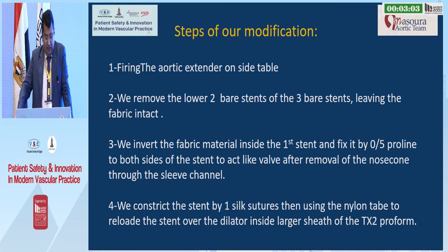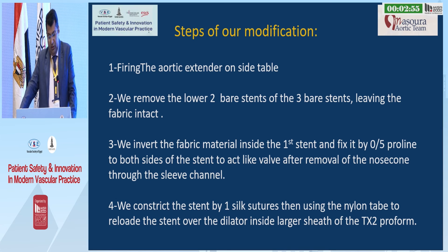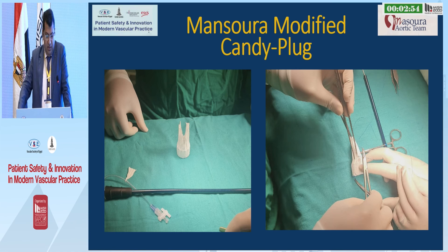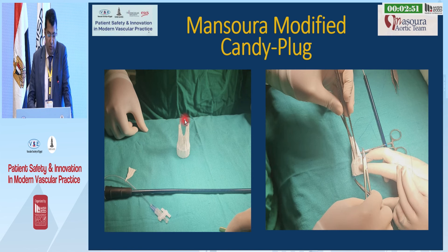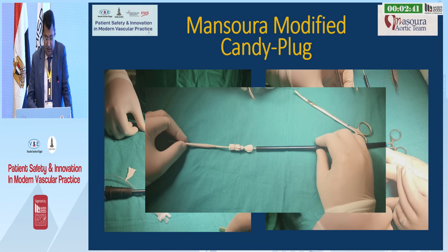We constrict the stent by one silk suture, then use nylon tape to reload the stent over the dilator inside larger sheath of the TX2. This is how the stent looks after removal of the two bare stents and excision of part of the fabric, then suturing and inverting the fabric, before reloading it inside the sheath.